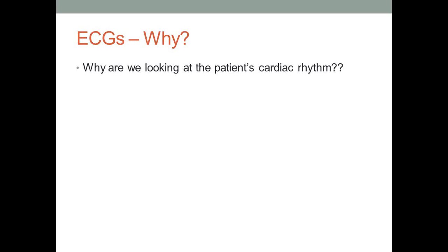So you need to make sure that you're assessing your patients appropriately, you're asking all the right questions, and then you're using your cardiac monitor and your ECG rhythm to either support your differential diagnosis or to maybe challenge it. And you're going to use the information in your ECG to make certain decisions. And that's what it's there for. It's a tool to use to help your decision-making process. So keep that in mind.